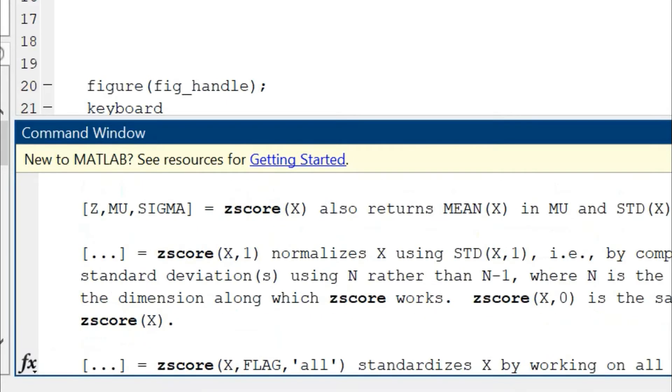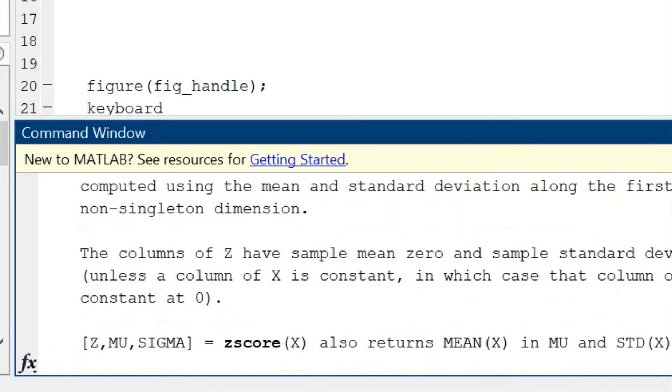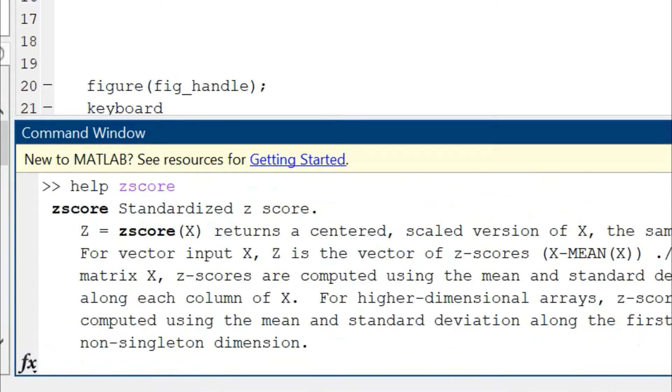It's equivalent to normalizing the data by subtracting the mean from it and then dividing by the standard deviation of the data. You can read much more about it using the simple help command.